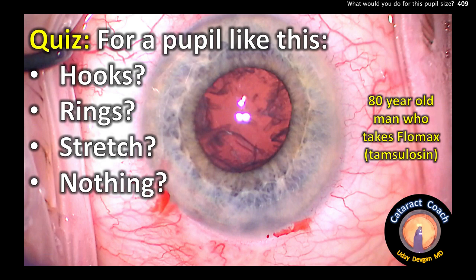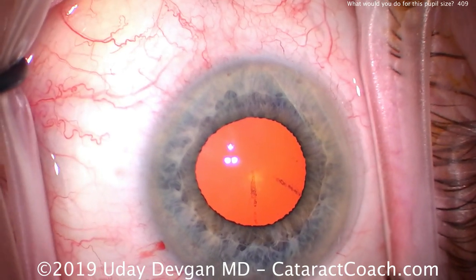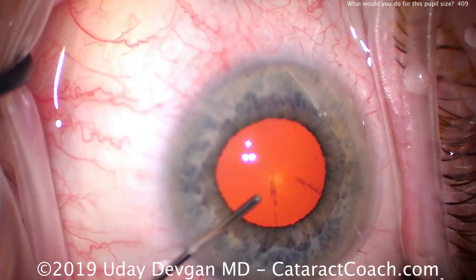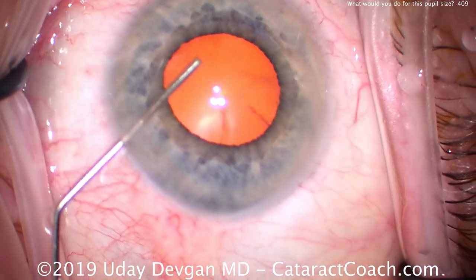From cataractcoach.com — quiz: for a pupil like this, do you use hooks, rings, stretch it out, or do nothing? It's an 80-year-old patient who takes Flomax, which is tamsulosin for prostate issues. As we know, that also causes floppy iris syndrome. So the first thing we'll do is inject anesthetic — preservative-free lidocaine under the iris.